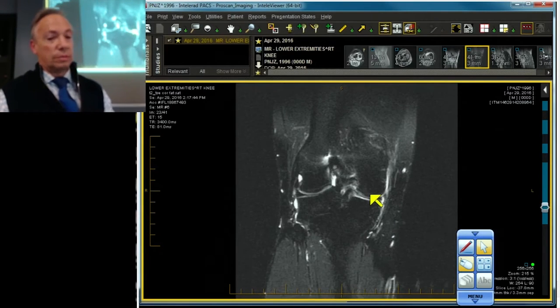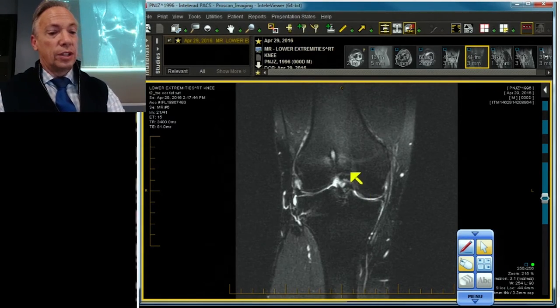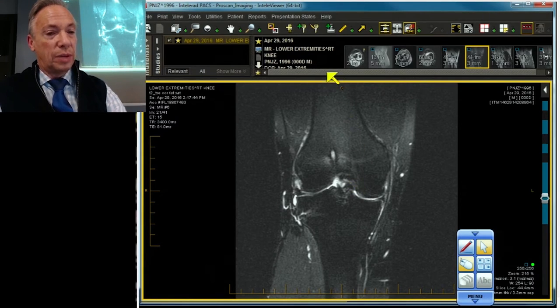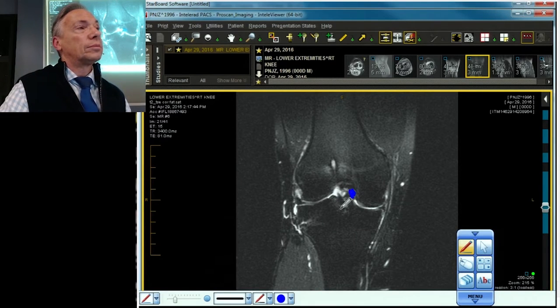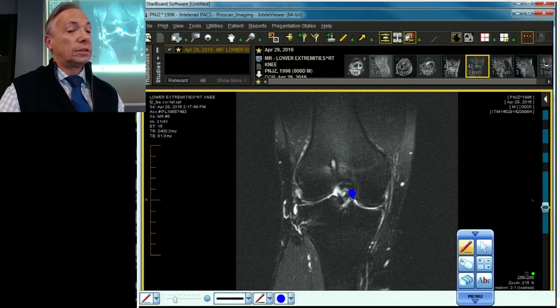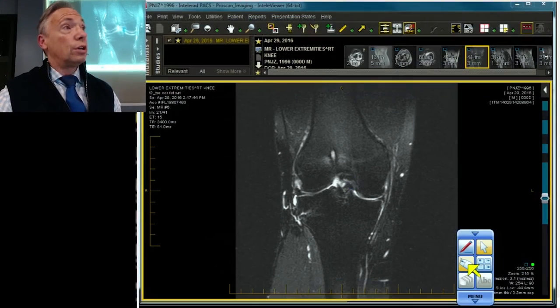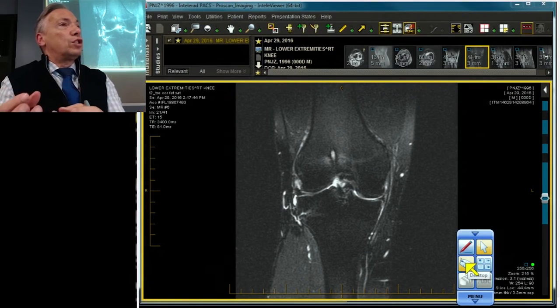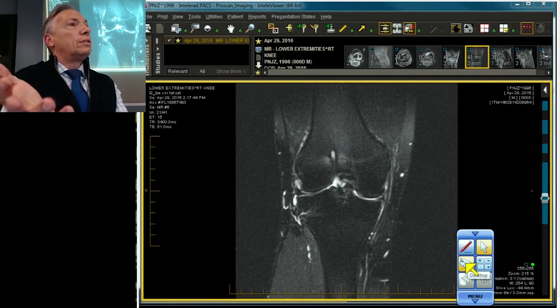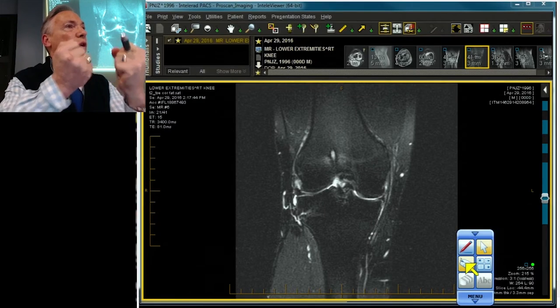Now what else can simulate this? There are two very important simulators of a bucket handle tear. One is an anterior large accessory bundle of the PCL that swings forward and inserts on the inside edge of the medial femoral condyle. You know it's not a fragment because it's dark like a ligament and you can follow it right back to the PCL when you scroll. This is a major cause of misdiagnosis, especially after meniscectomy — the meniscus looks small, you find this extra ligament and connect the two, thinking you have a bucket handle tear. You don't. The menisci have to come back together again, or at least oppose each other.